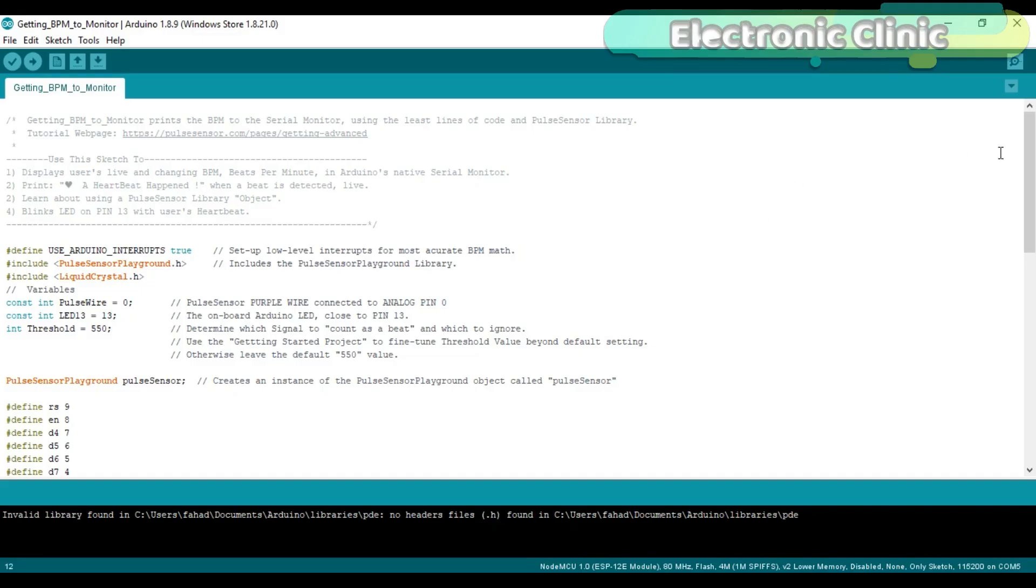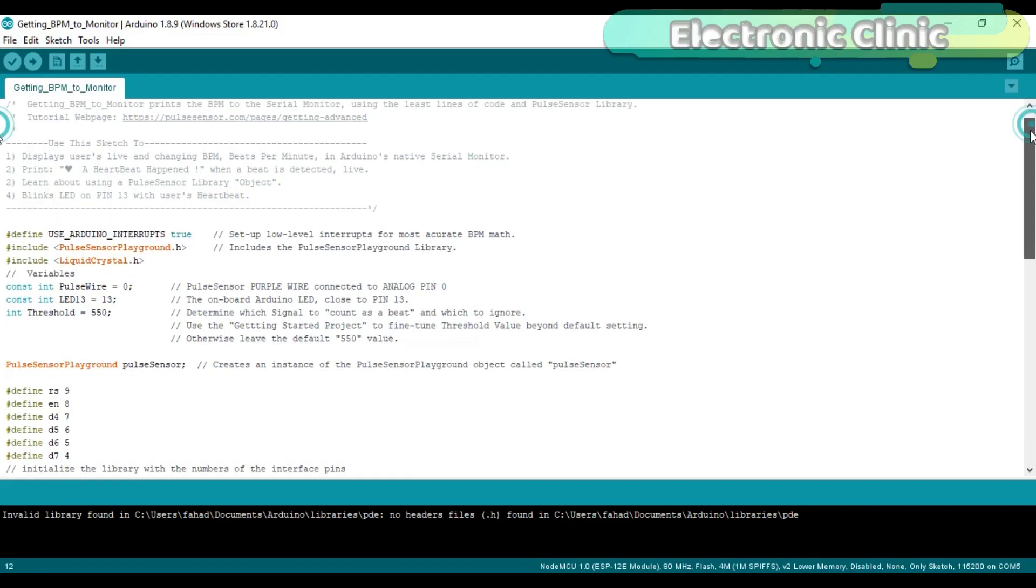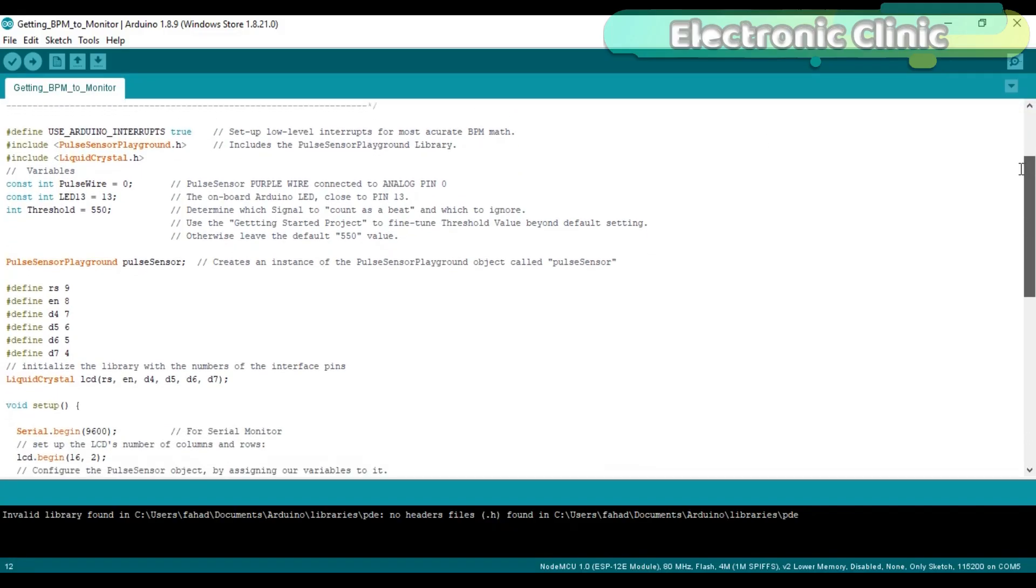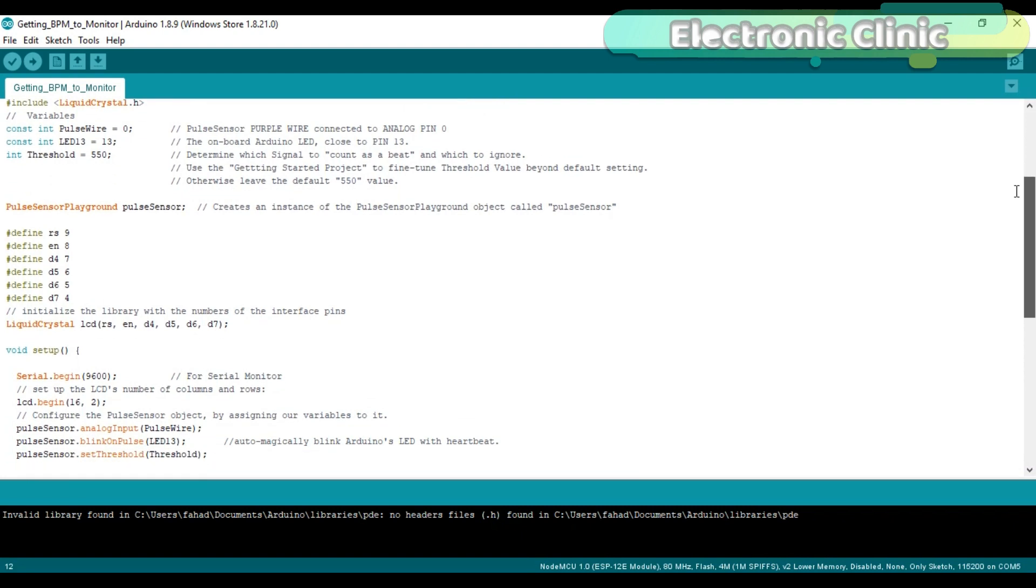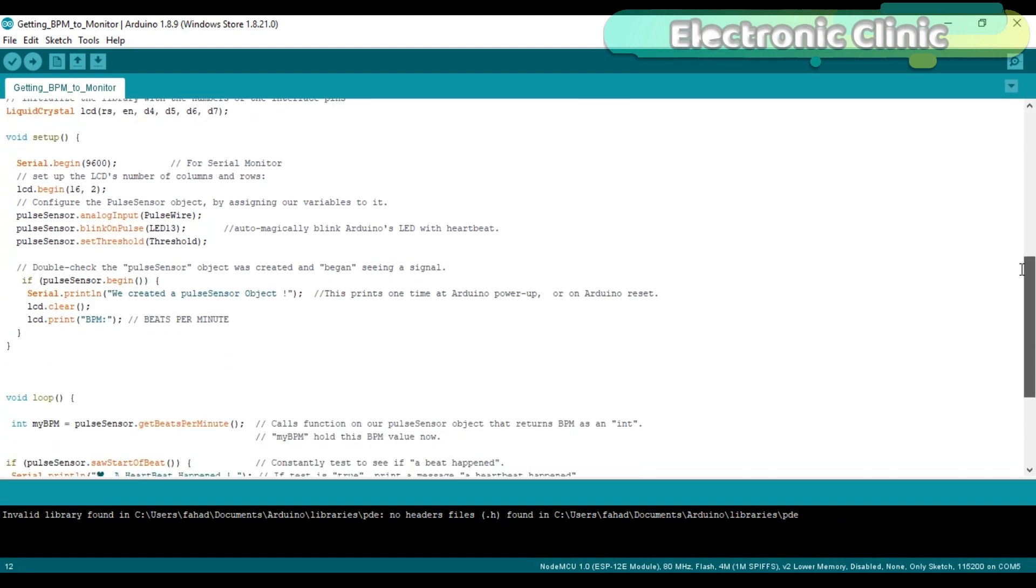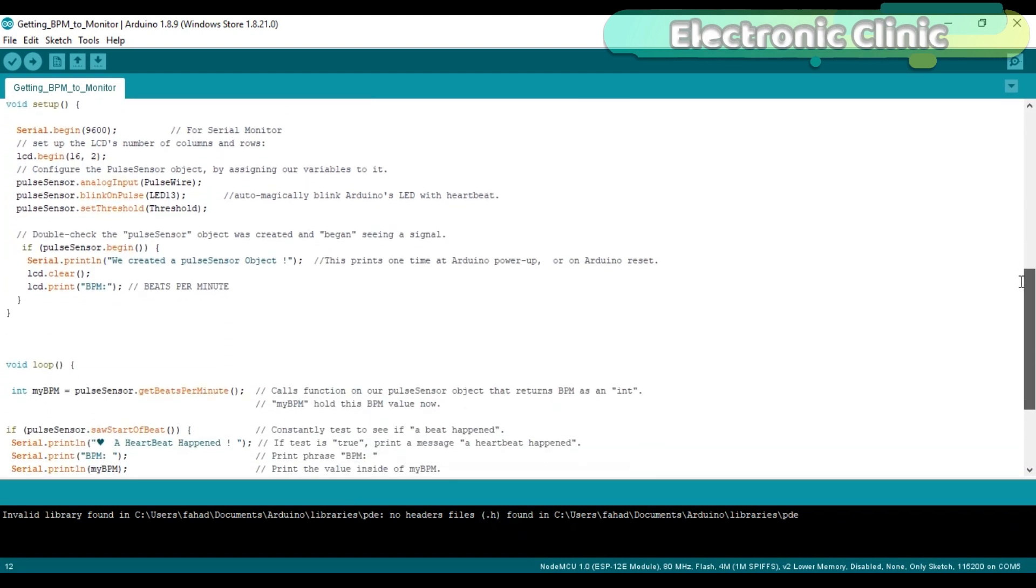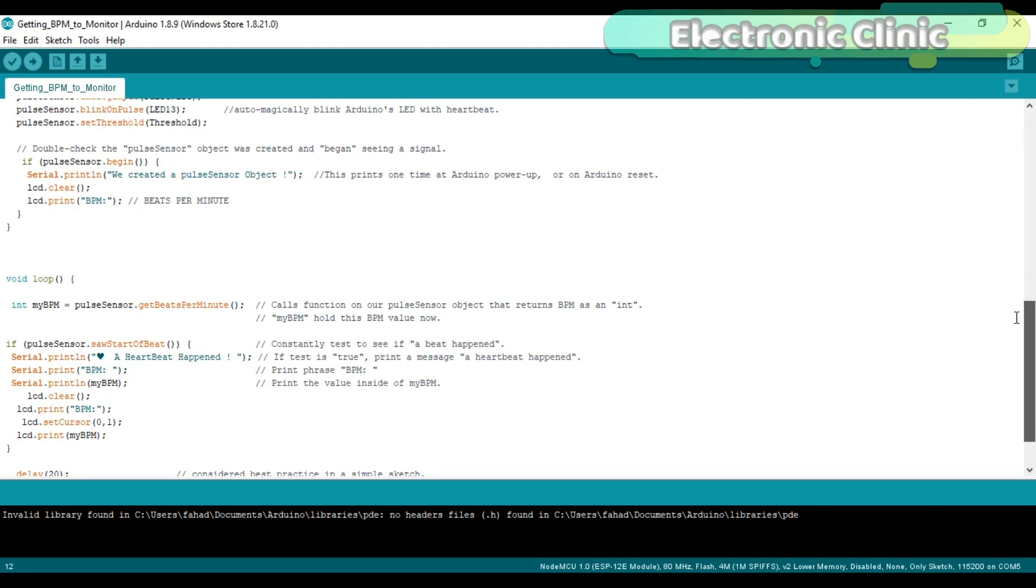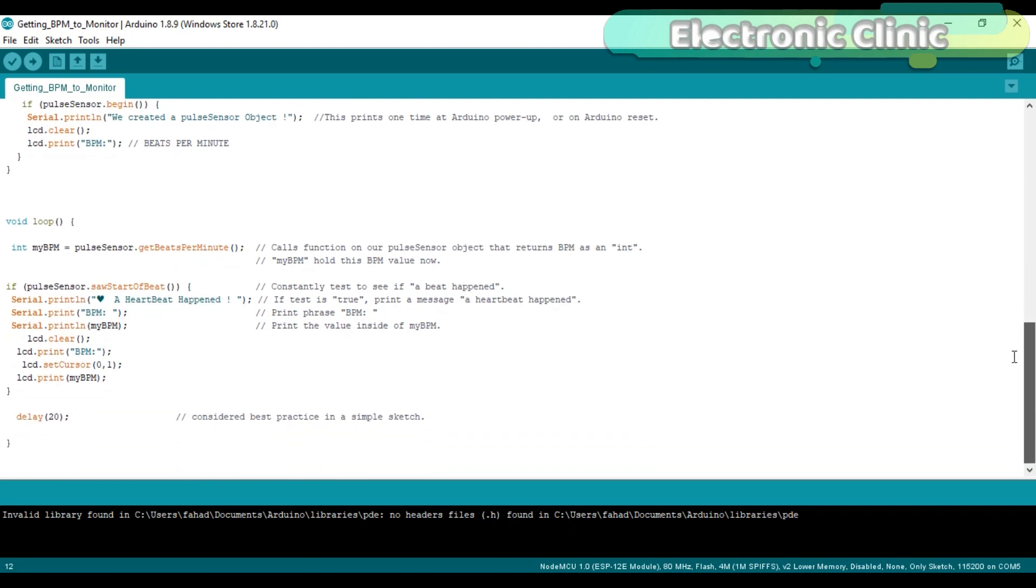This is the same example program which I have already explained in version 1 of the heartbeats monitoring system. I didn't even change a single instruction. The modification is only on the hardware side. As you can see in the programming, I am sending the text and values to the Bluetooth module using the serial communication. So this time I am using the Arduino's default serial port for the communication with the Bluetooth module.